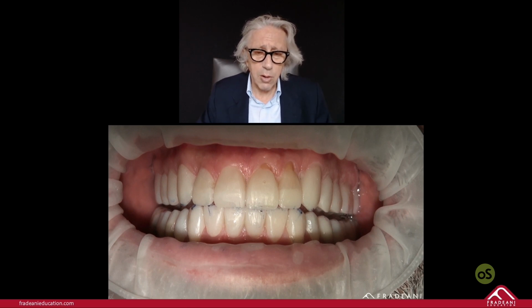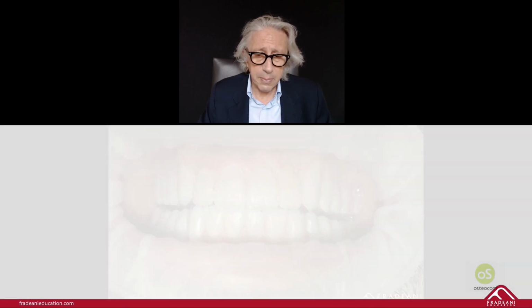Why did we do it? Because this mock-up became for me the final work already. And now I can work, cutting back this mock-up with my preparation and starting to take the final impression.